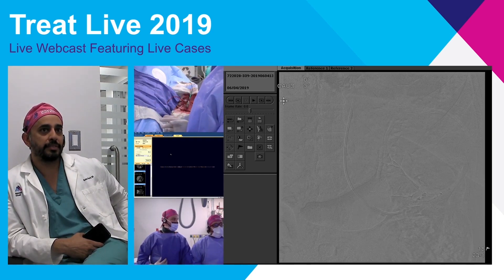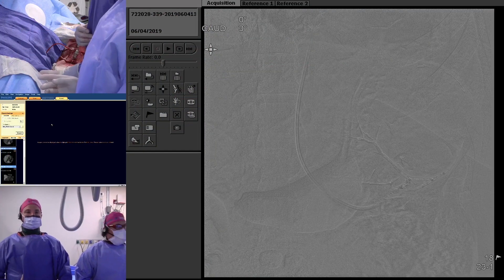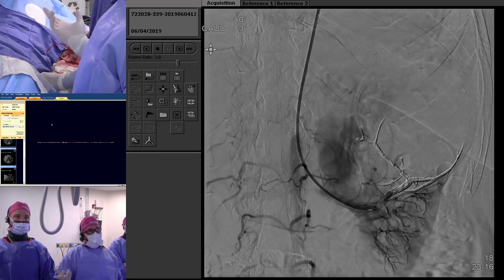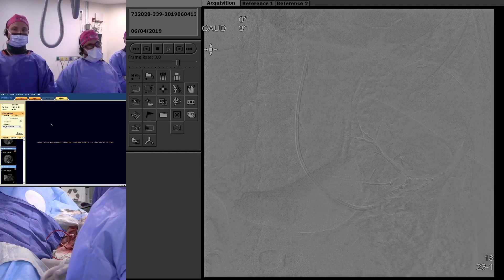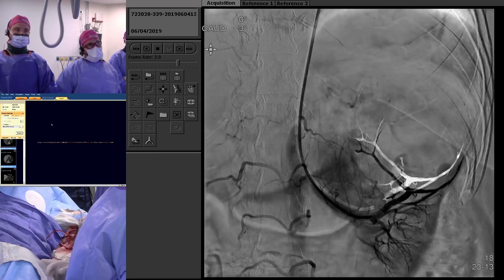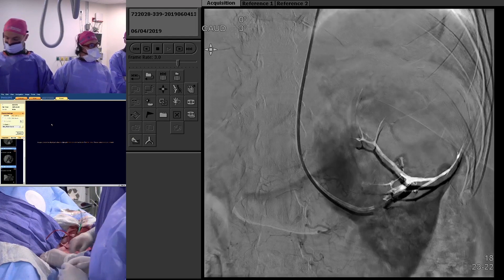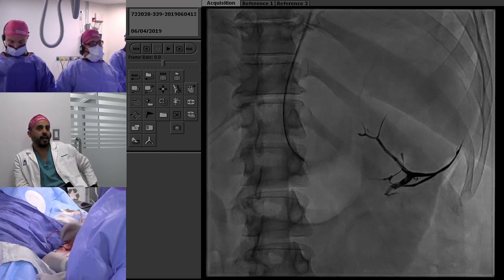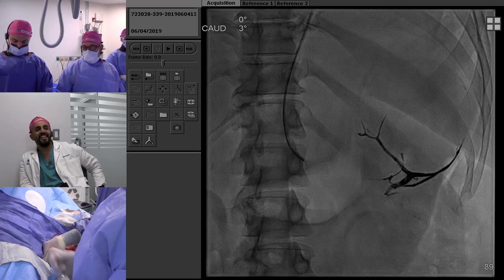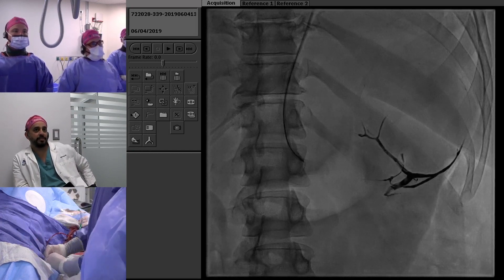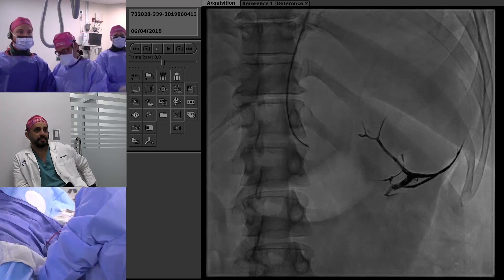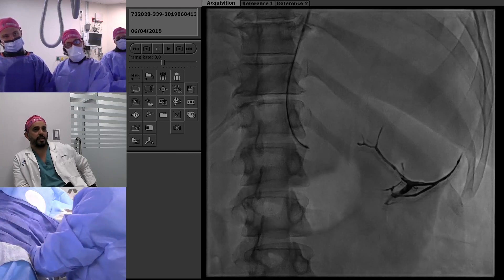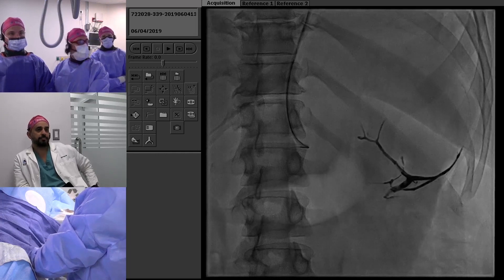We found another capsular branch coming off the aorta, and there's another feeder that's very proximal off the renal, which I'm going to leave alone for now. I'm probably going to have to bring her back and stage this. We're going to try for the capsular branch while you're here, and if not, we'll do it all in stages because I really want her to be comfortable after this — that was her big issue. I have a ProGreat 2.4 at 1.50 and Paul is going to probe around that origin. The balloon was very helpful because it prevented reflux more than anything, so we got pretty aggressive at the end. I would have preferred a little bit more distal penetration, but it's the best we could do.